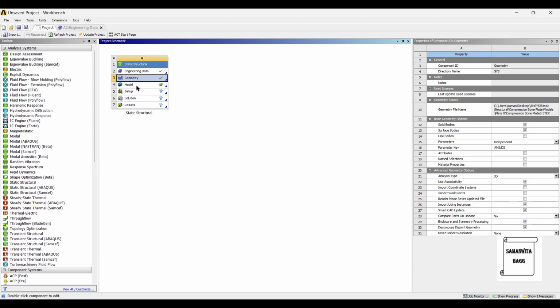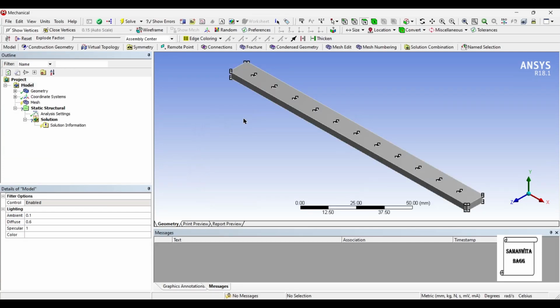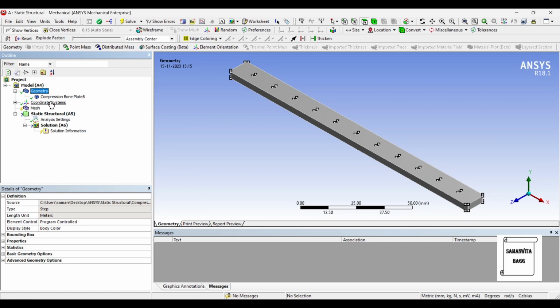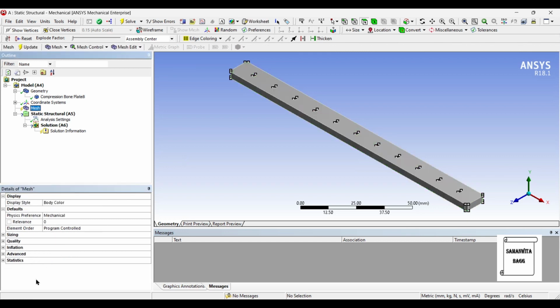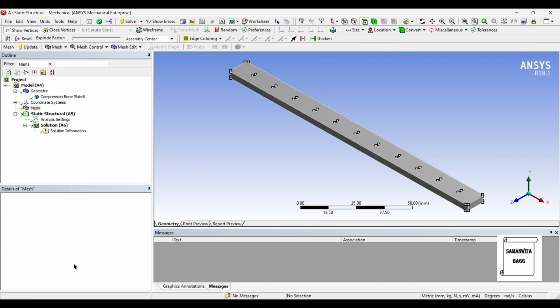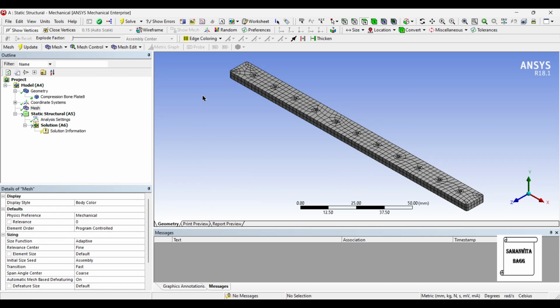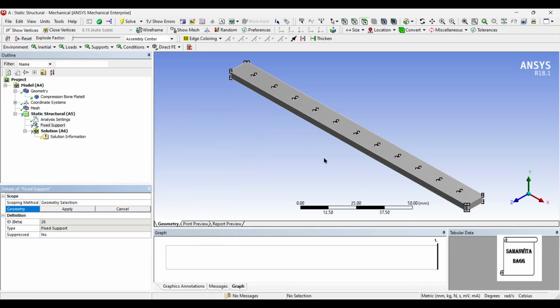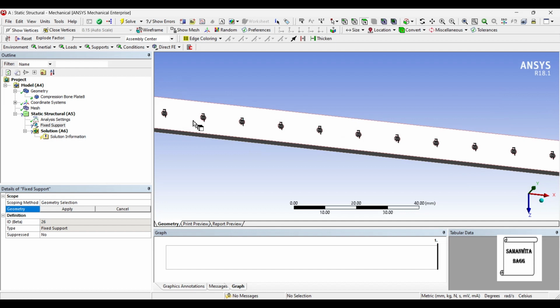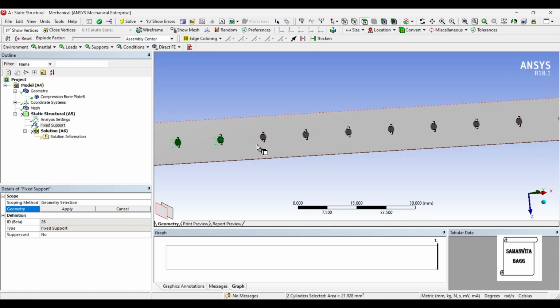Next, I'll go to model and double click on it. I'll first go to geometry and change the material of the compression bone plate to stainless steel 316. Next, I'll go to mesh and change the sizing to fine and update. Then I'll go to static structural and insert fixed support. Now, as you're aware, these holes are the places where we are going to fix the screw. So these are the fixed ends. So I just select these circles.